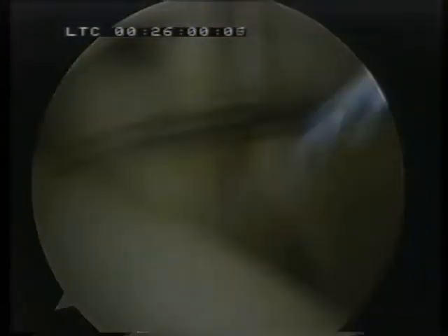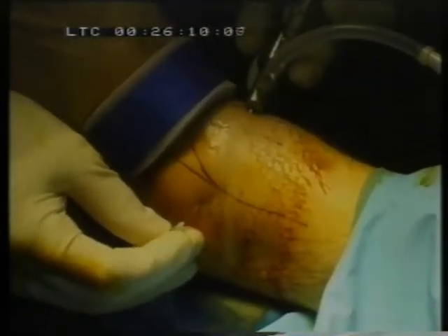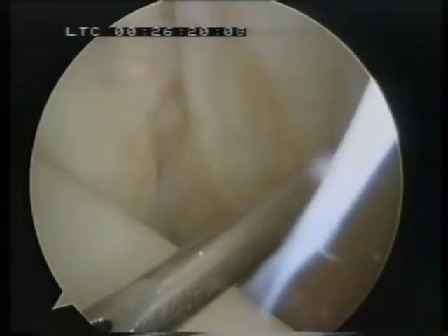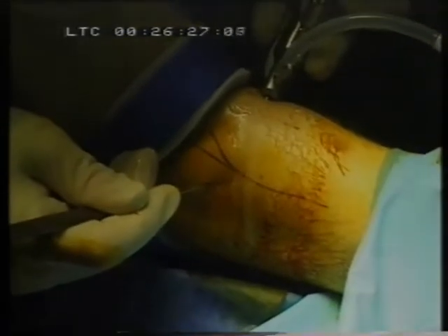Once the needle is in, you identify whether you can do pretty well everything that you want to. You can place accessory portals, as per Ferkel, at what are called accessory portals, which are down lower. But here, all I need to do is remove some of this synovial material, particularly where he's getting most of his pain on the medial aspect of the tibial joint, and then make an incision just going through the skin only.